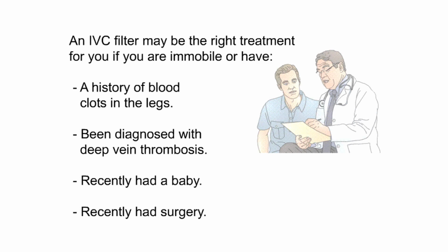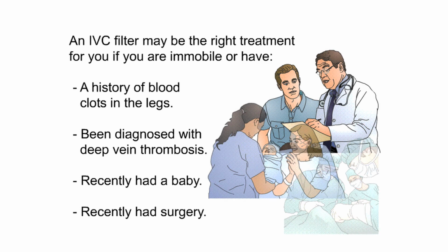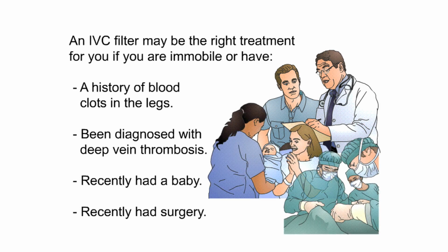An IVC filter may be the right treatment for you if you are immobile or have a history of blood clots in the legs, been diagnosed with deep vein thrombosis, recently had a baby, recently had surgery.